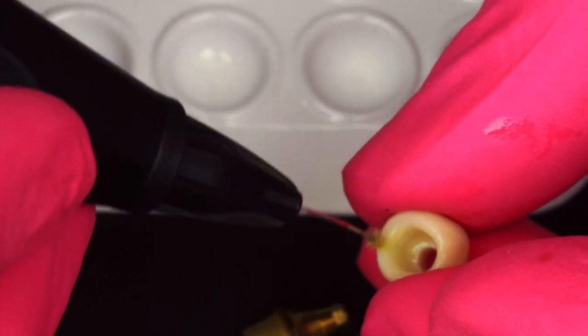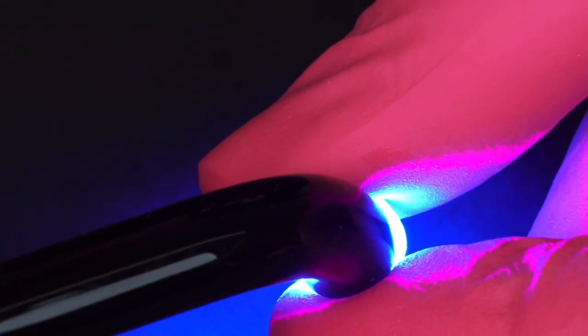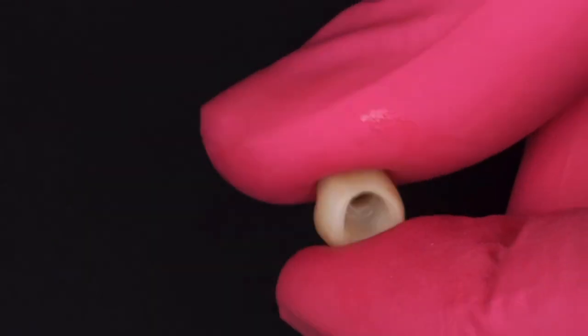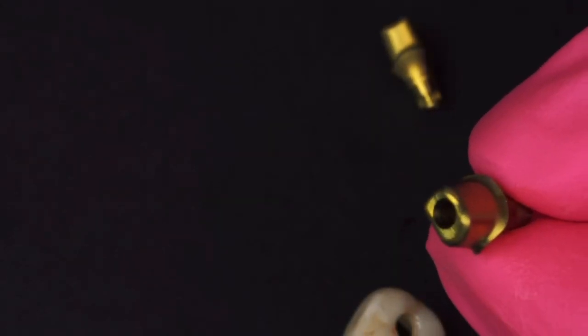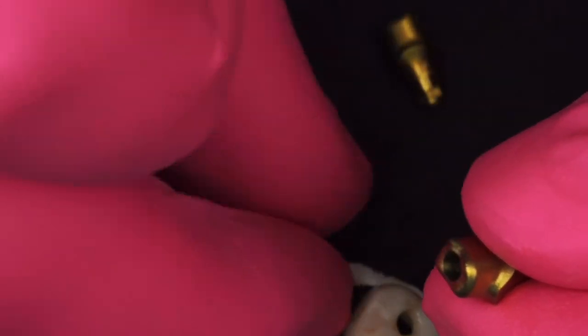Now what's unique to this particular protocol compared to if I'm bonding on natural tooth structure, like if I'm bonding veneers, is I'm going to actually polymerize this adhesive after I blow it thin. Make sure you blow it thin or else you're going to get binding and you won't get seating of your restoration. The reason why I'm going to polymerize this is because Ivoclar's multi-link abutment cement is actually auto cure only. This is why it's also important to use a dual cure compatible adhesive. If the adhesive is one that's not dual cure compatible, it will set up acidic and the hydrogen will protonate the amines of the tertiary amine benzoyl peroxide initiator system, preventing curing of the resin cement right along the interface where it meets the crown.